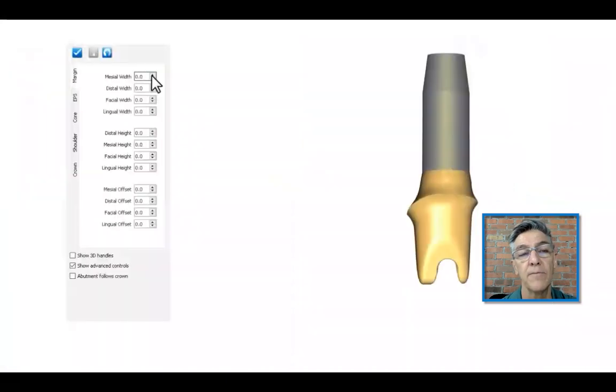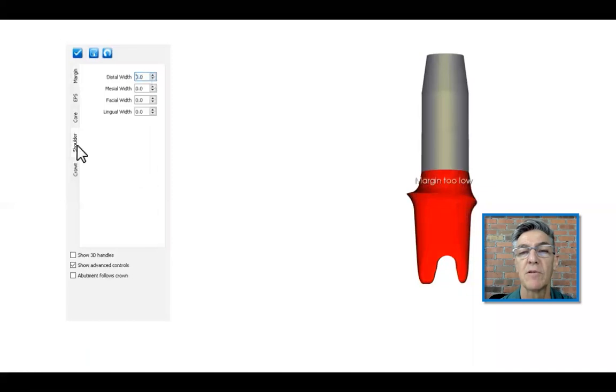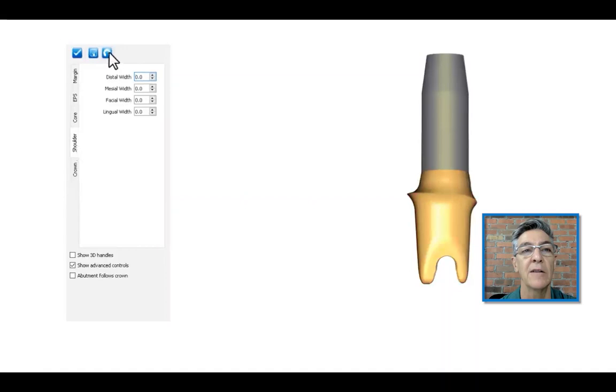Once they have the abutment, they can then edit the shape as they would prefer — width, height of the above margin, whatever they want to do. If they go a little too far and design something that can't be produced by Atlantis, the image turns red, and all they have to do is go back on their design a little bit. Once done, they check the box and say okay, we're all set. That is the workflow for Atlantis custom base. Thank you very much.